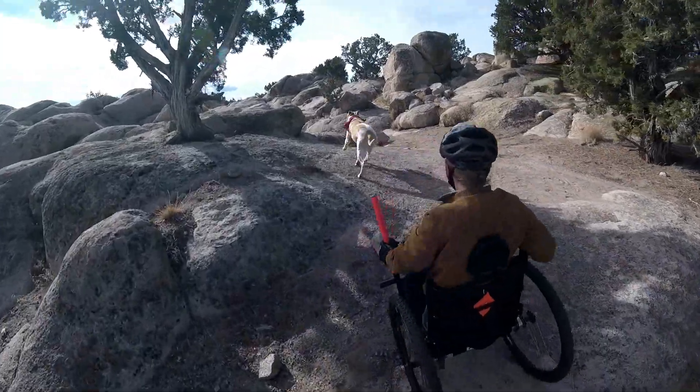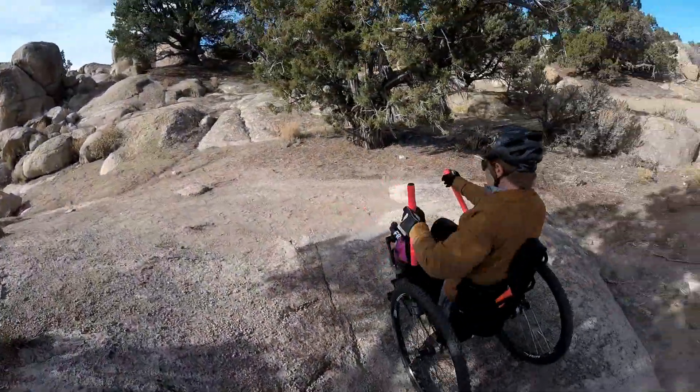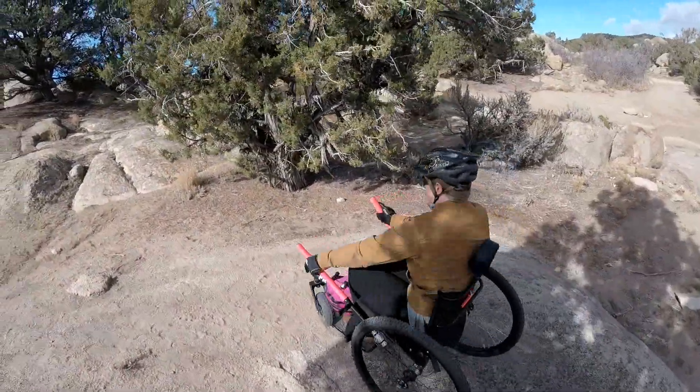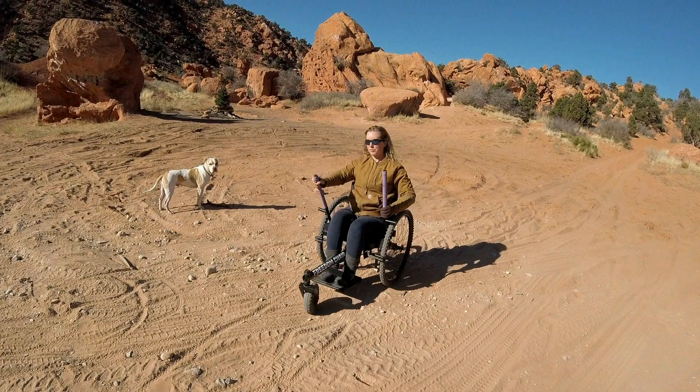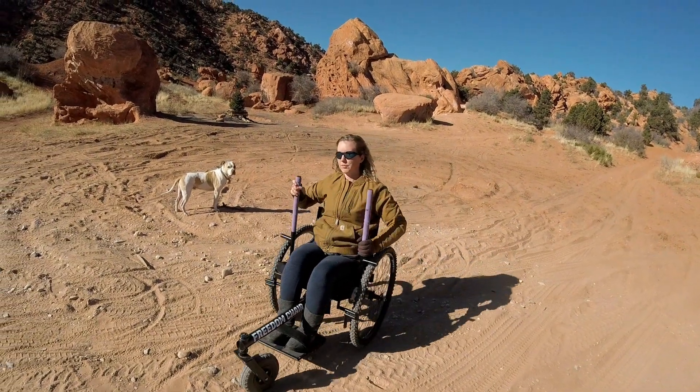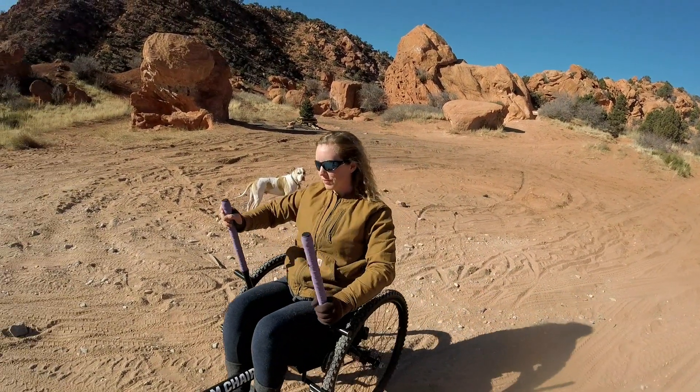You can place your hands anywhere on the lever, allowing you to quickly and easily manipulate the Freedom Chair as your route's terrain changes. You can even alternate the position of your hands if the path you are on has a little bit of a side slope. This allows you to keep moving forward with equal lever pushing, while allowing the most effort to go where it needs to.